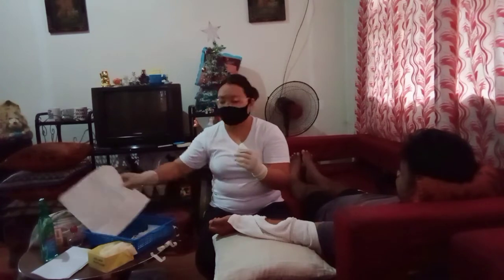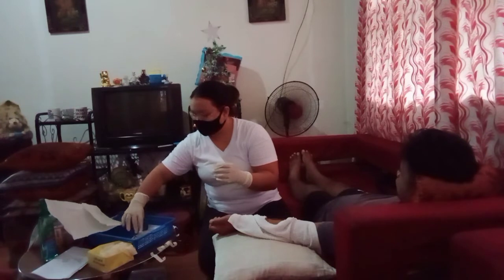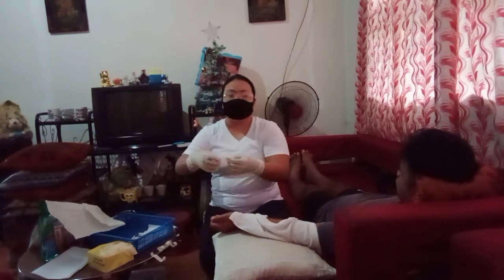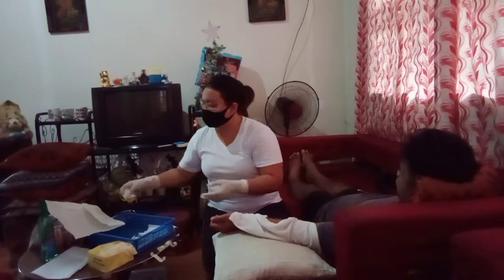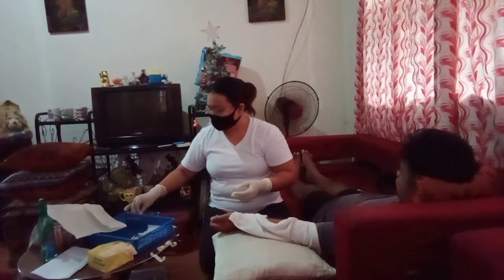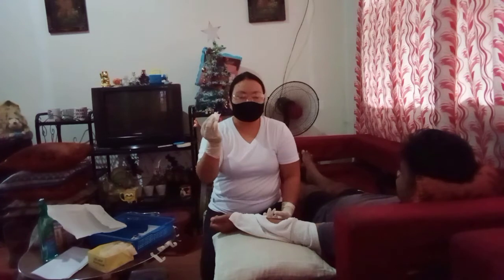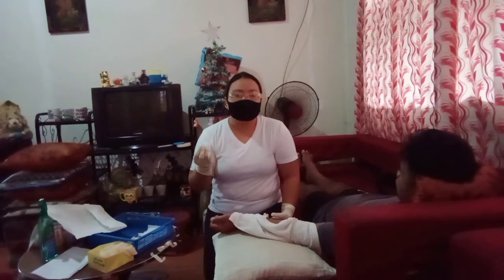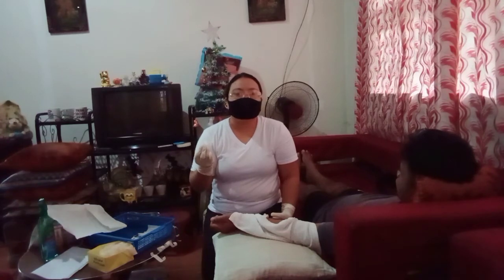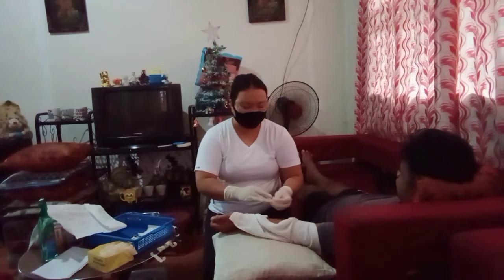Okay, so after applying, take a gauze, then soak it in the solution in the basin. Then one gauze per stroke. So you must clean the wound one stroke only, from least contaminated to the most contaminated area.